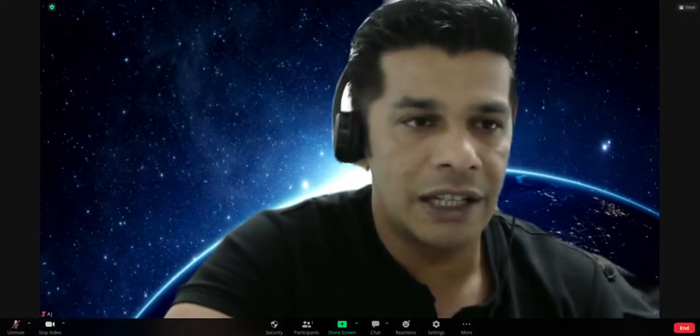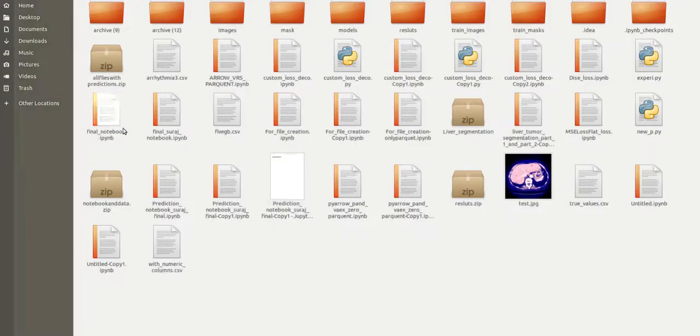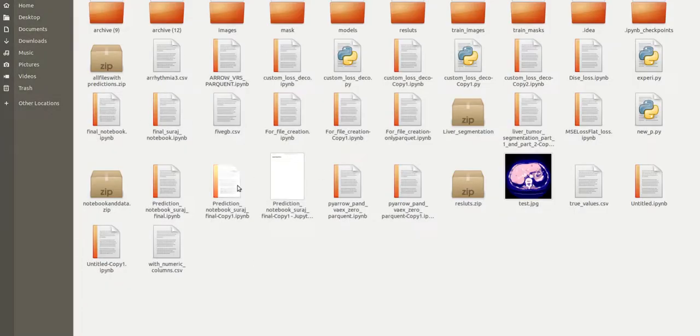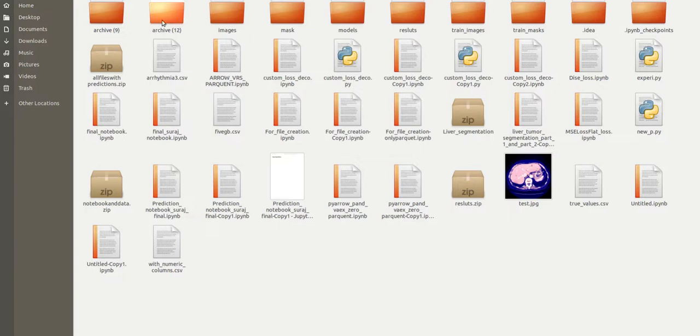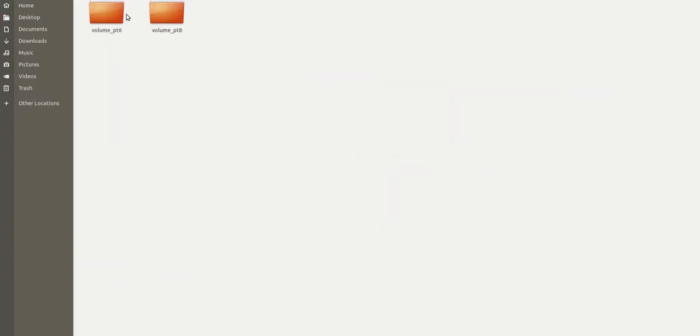We're going to use PyTorch and FastAI for this implementation. Let's move forward and see what the dataset looks like. I hope you can see my screen.